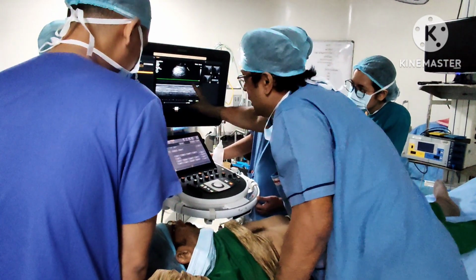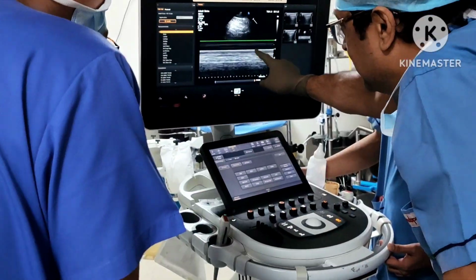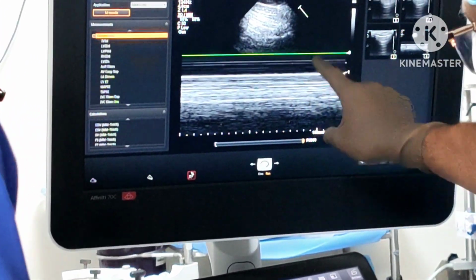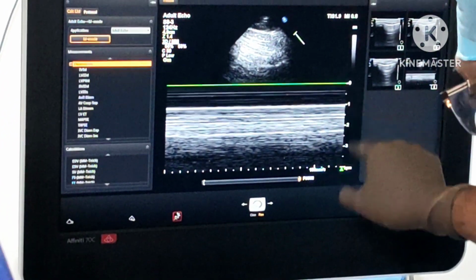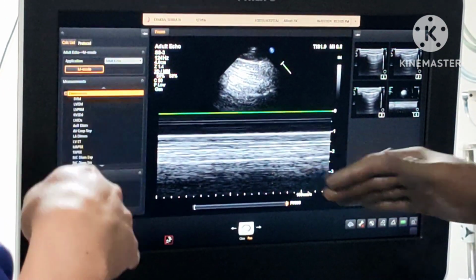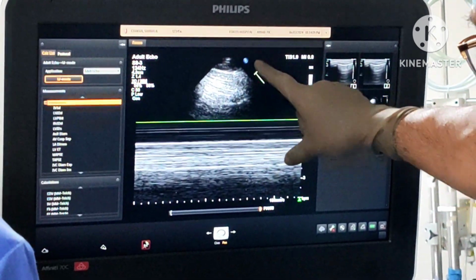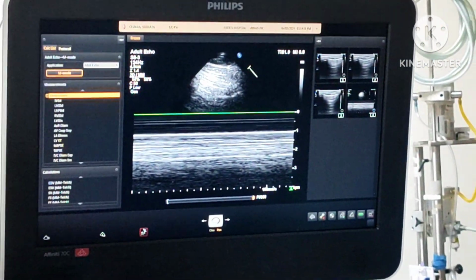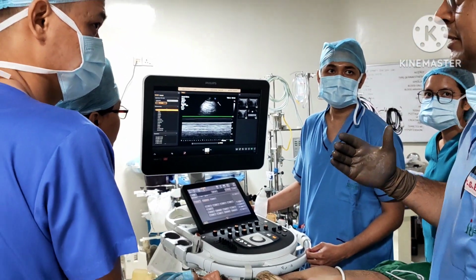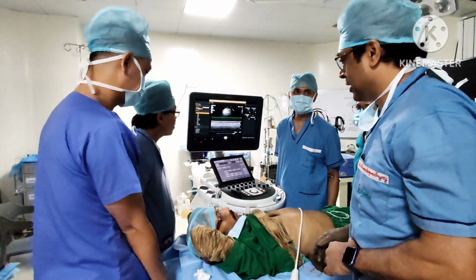And in this part where you have the pneumothorax, the entire thing will become like the image you see on top. The point where you see the difference between a normal lung and that of a pneumothorax is called a lung point. Okay? Got it?